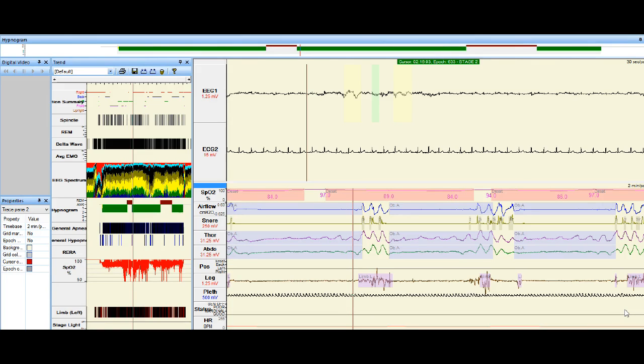Now at the other end of those wires, all those signals feed through to a computer and this is what it looks like on the screen. I'm going to show you things we look for when we're determining whether or not someone has sleep apnea.